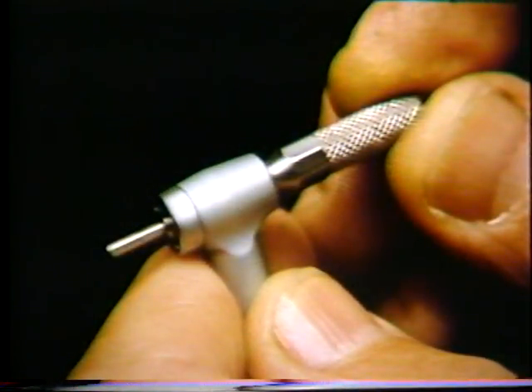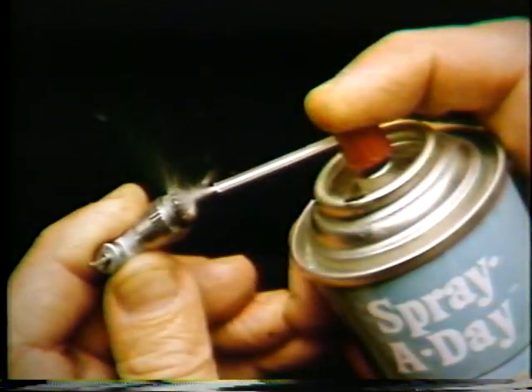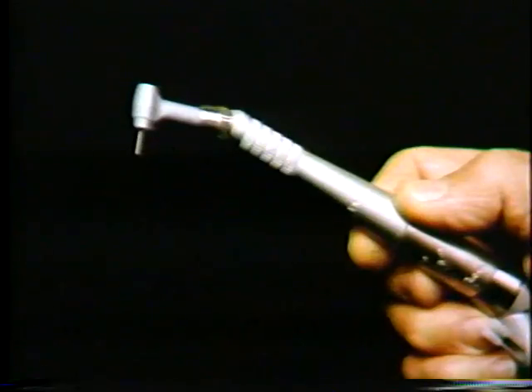Insert the dummy burr and tighten it down. Spray the drive shaft in the same places as you would for the daily maintenance, and also spray into the back end of the contra-angle. Then reassemble the contra-angle and run it for a few seconds.